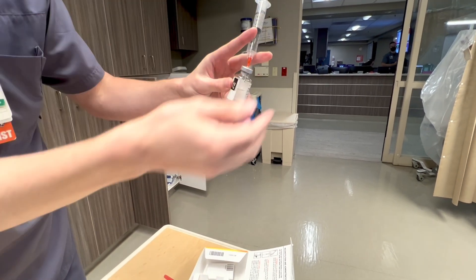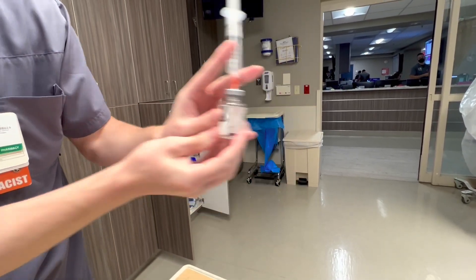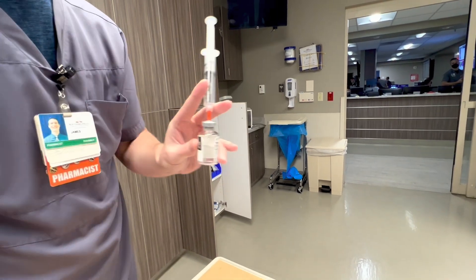Then it'll be a little foamy. This has already been mixed, so it's already clear, but it'll be foamy when you first mix it. Just gently swirl for about 30 seconds.